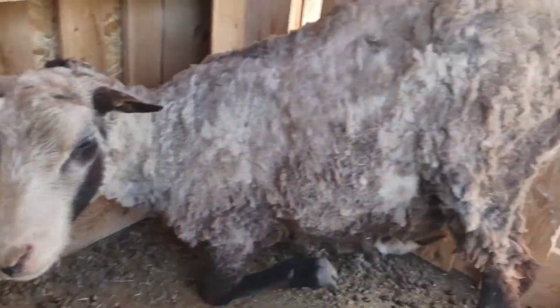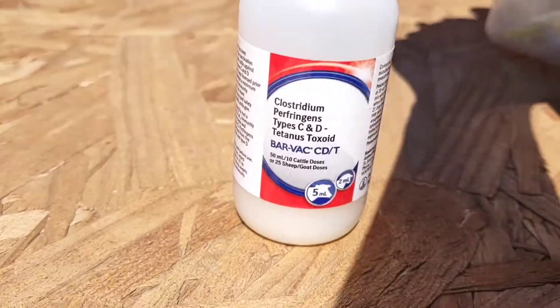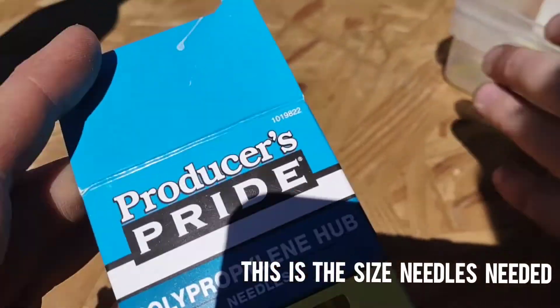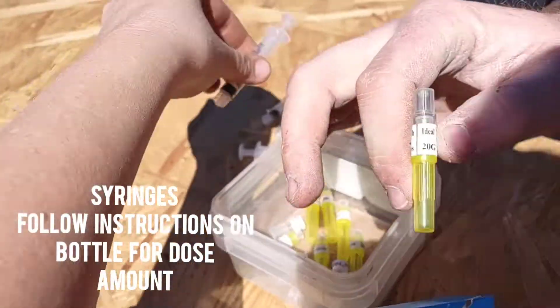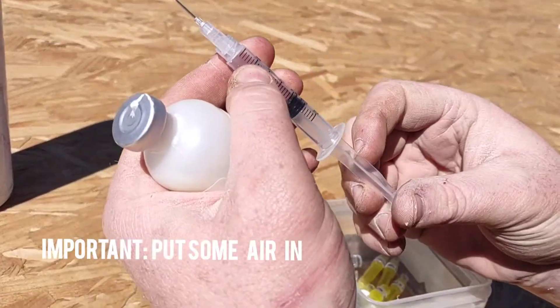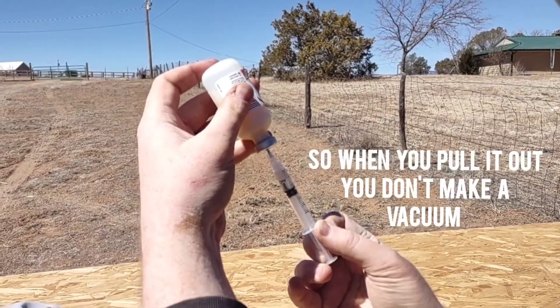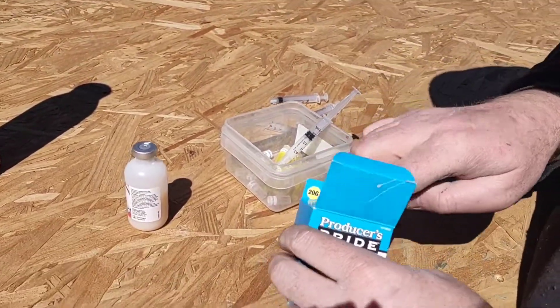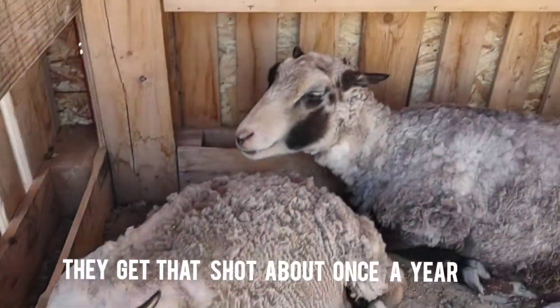Good job buddy. Now this is the bottle we're using for it, and these are 20-gauge half-inch needles — they've got a really short needle. We just have these syringes and you follow the instructions for how much. It's pretty simple. You put some air in so that when you pull it out it doesn't leak back on you. Make sure that you don't go through the skin on the other side, and they just get that shot about once a year.